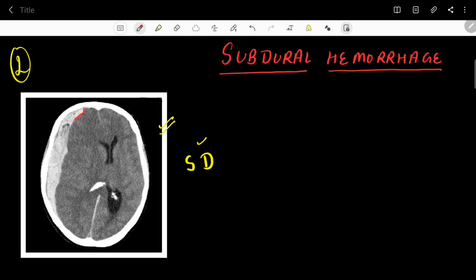Firstly, let me tell you about the CT finding. This is the white colored area that you can see here, and this is more or less a crescent-shaped — or you can say concave-convex kind of — appearance. This is the typical finding in subdural hematoma.